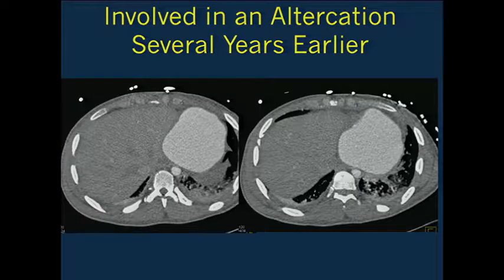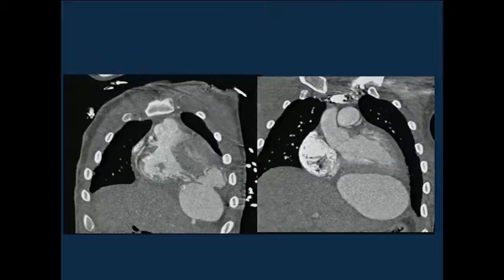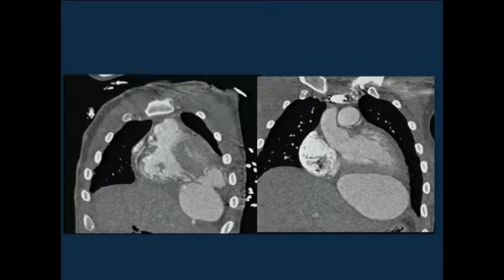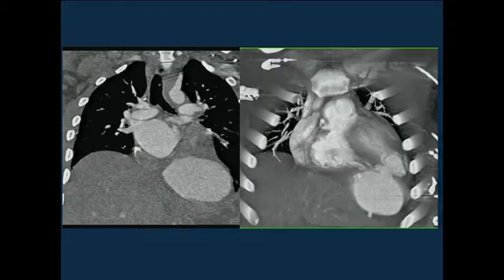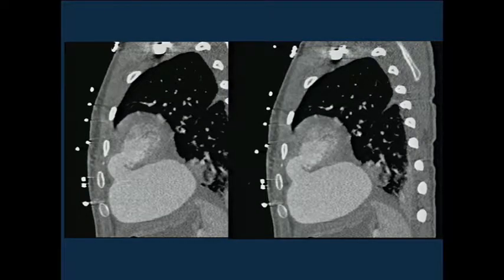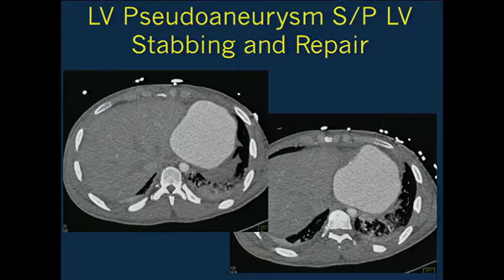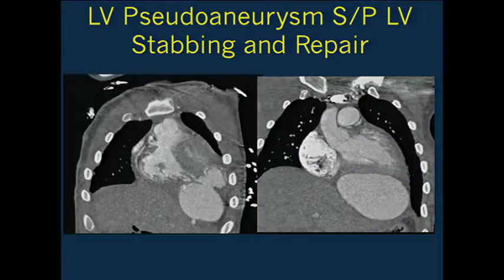Another case: a patient who comes in with chest pain from prison, given oral contrast. He was in an altercation several years earlier, had cardiac surgery, was put back in prison, comes back now with chest pain, and was felt to be a malingerer. But malingerers have pathology as well. Looking at the sagittal view, this patient developed a pseudoaneurysm recurring near the site of prior repair—his first scan two or three years earlier looked almost identical.